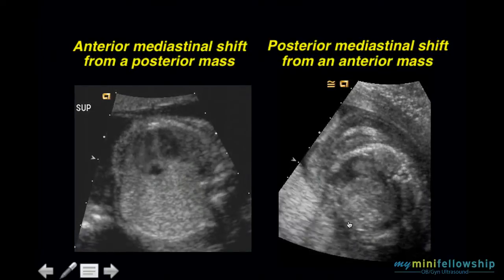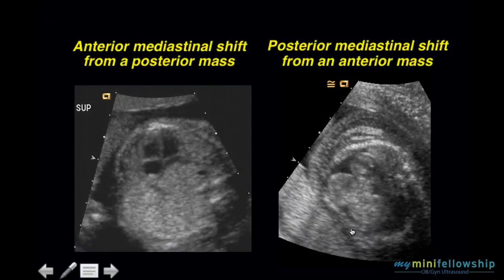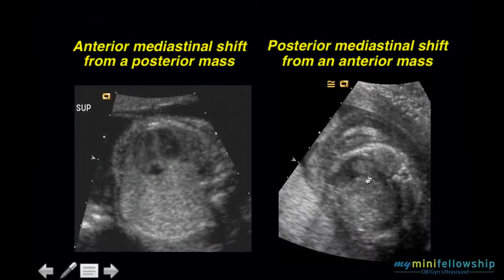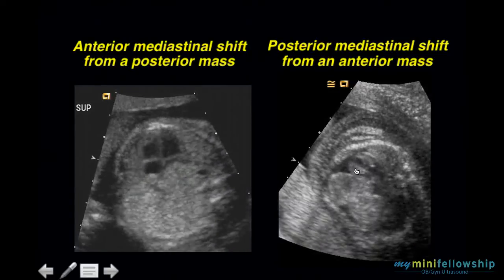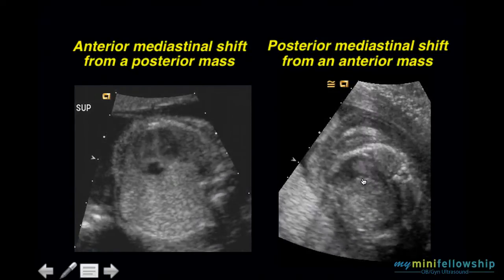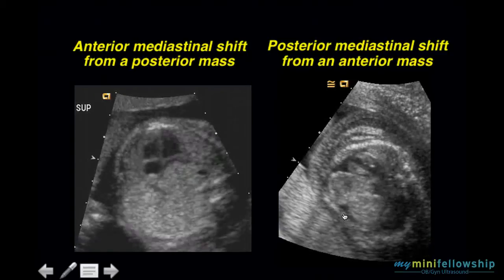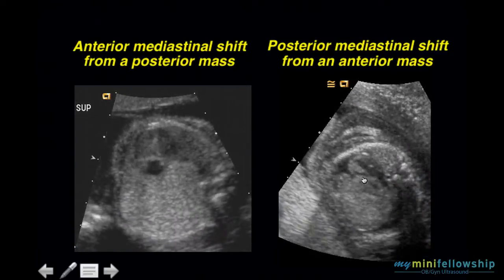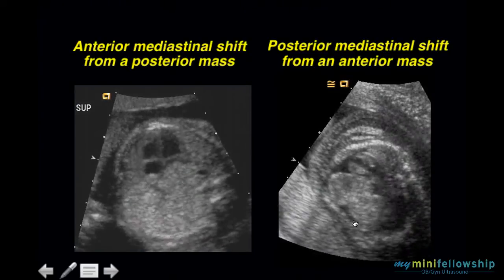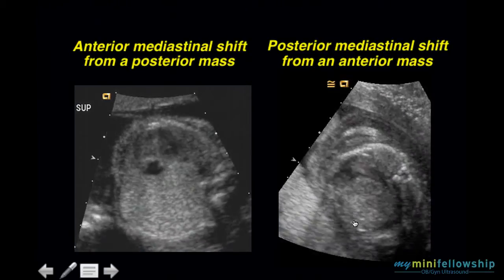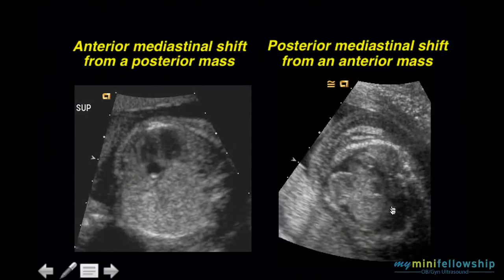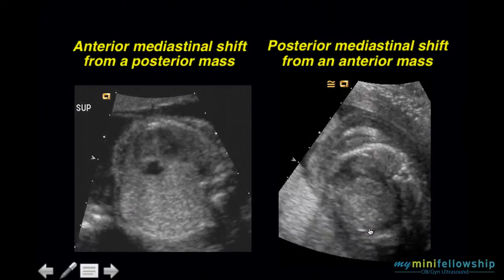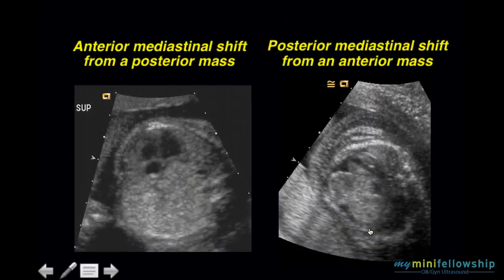Here in this transaxial scan of the fetal thorax, you can see the left ventricle and the right ventricle anterior wall. Here's the anterior chest wall, and clearly the anterior wall of the right ventricle is not in contact with the anterior chest wall because it is being pushed posteriorly by this rather formidable mass.